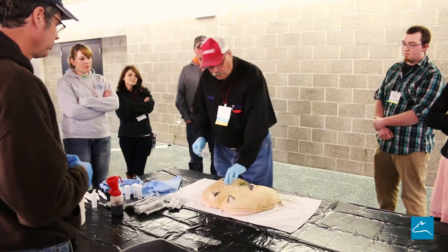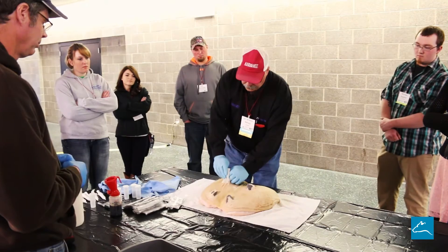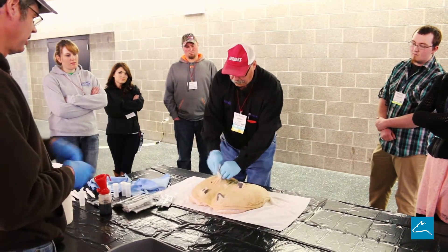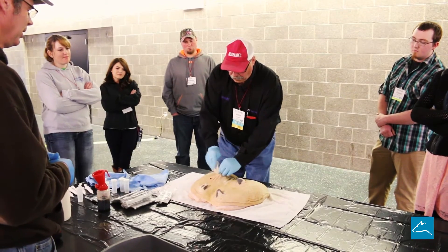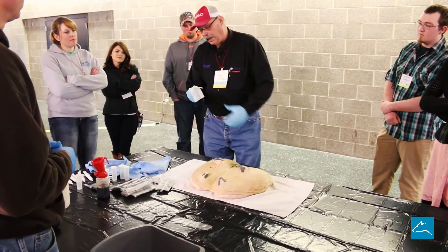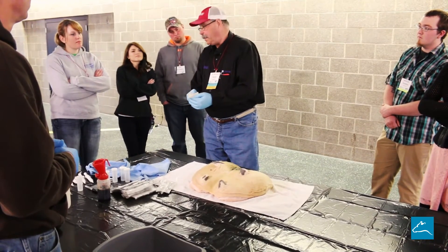We got the teat end dry. The critical part of the whole thing is just this end. Look at the junk I can get off of here — you got a nice chunk there. Notice the towel at the end of that, and quite frankly, this isn't too bad.